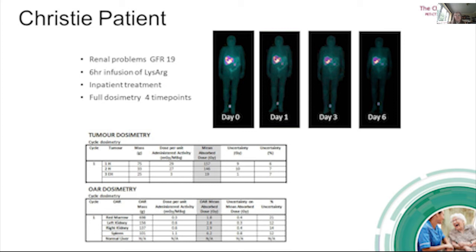Well, we looked at the tumor dosimetry and we can immediately see there was 150 gray or so to the hepatic tumors, not as well in the extrahepatic tumor. But we expected to see large kidney doses, but this wasn't borne out by the imaging that we were able to see, with virtually no renal uptake. So instead, our focus moved to the bone marrow dosimetry, and the bone marrow is irradiated by the circulating blood because the kidneys were not taking the radioactive agent out of the circulating blood. And in fact, we showed that within just one cycle, this patient received 1.8 gray in the bone marrow. So obviously the decision was made that we needed extreme caution to proceed any further. And sadly, this gentleman was too ill to carry on.